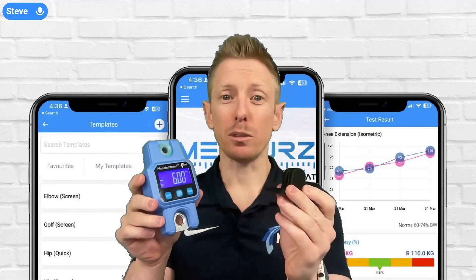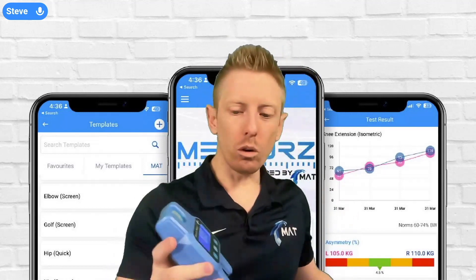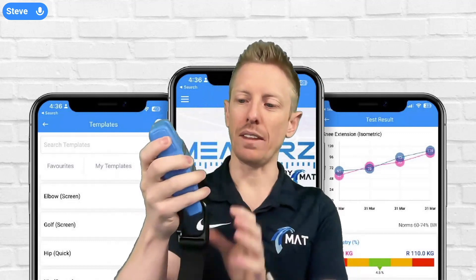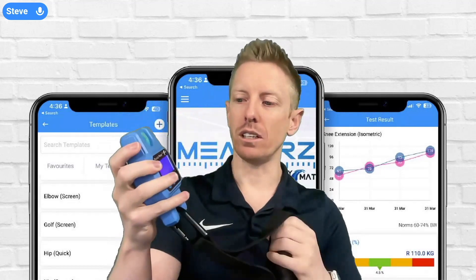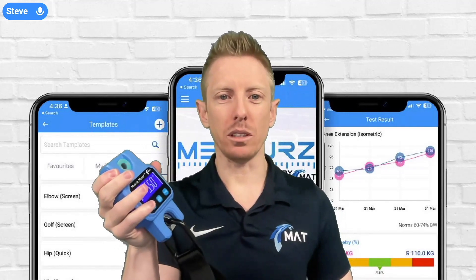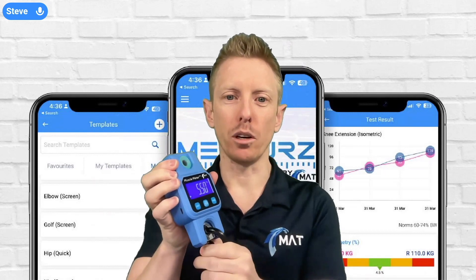We've talked about the push cap, which is one attachment you can use with the muscle meter. We can also get our handle and leg strap attachment. If I reset the device, it goes from compression or push mode, and when we apply some pulling force on that handle, all of a sudden we're working in pull mode.